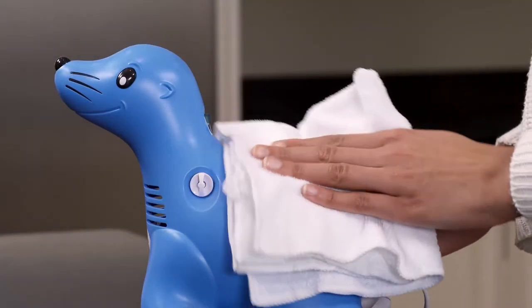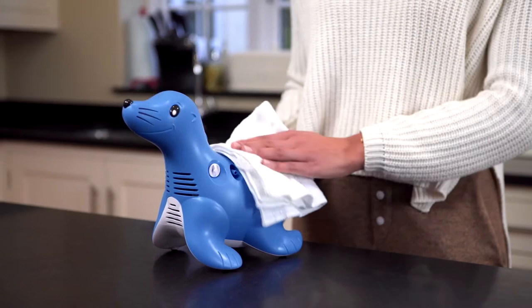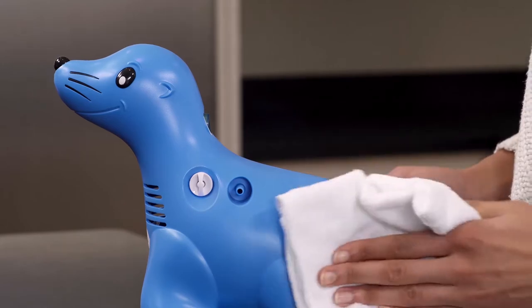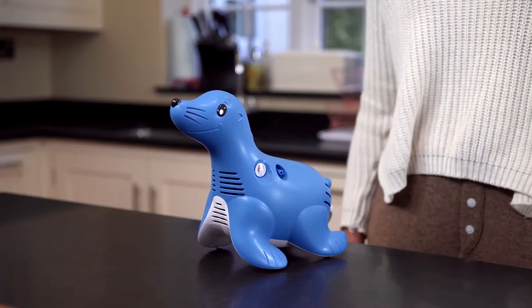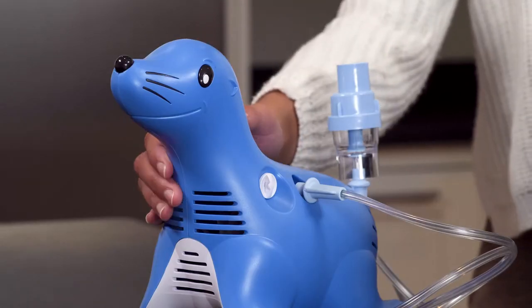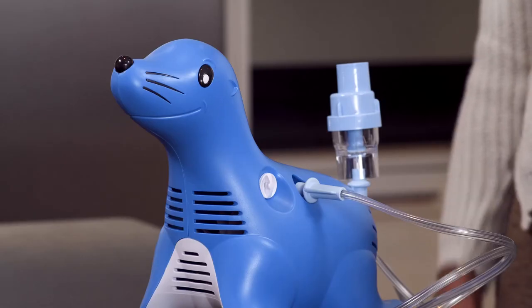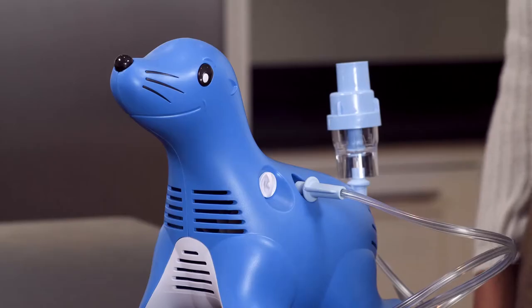Always unplug the Sammy the Seal compressor before cleaning. Sammy the Seal can be cleaned by wiping down the outside of the compressor with a clean damp cloth. Do this at least once a month. After cleaning, check that the unit is working properly by verifying that air still comes out of the nozzle when the unit is turned to the on position.